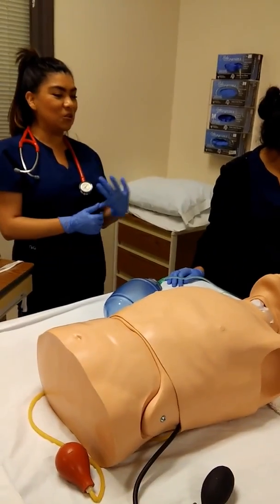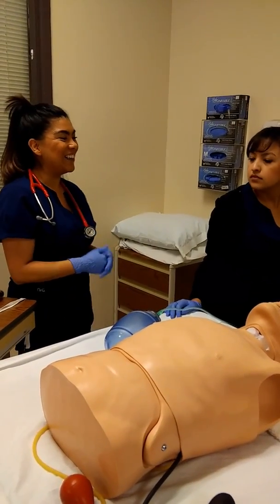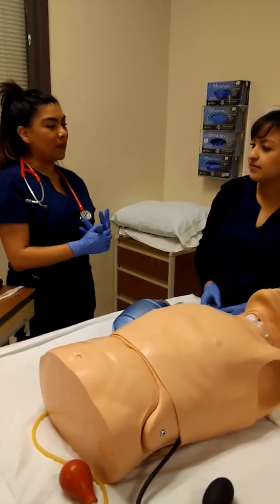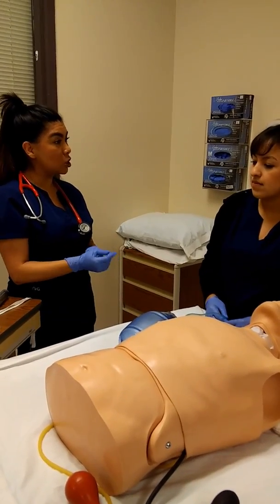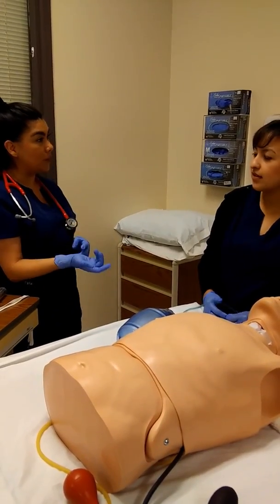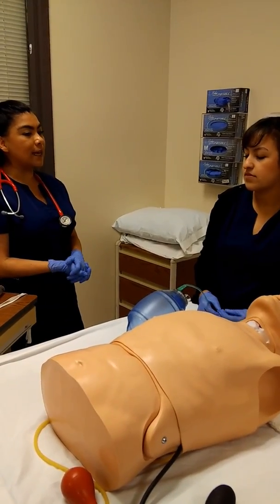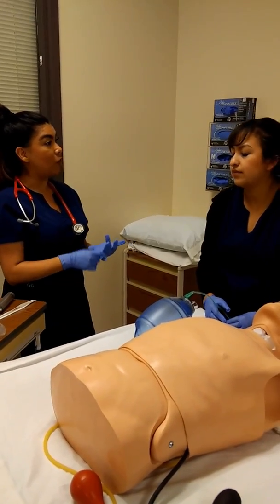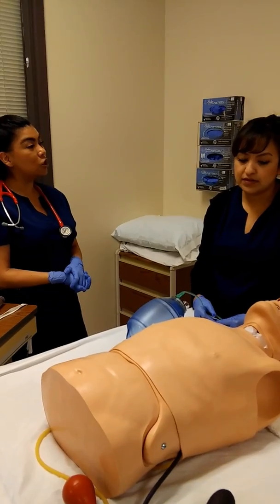Hi, my name is Mickey. I'm a respiratory care student, and it looks like your loved one is having difficulty breathing and maintaining an open airway. So we're going to intubate them to help open up their airway, to help them breathe better. Some complications that could happen is that the patient could have airway trauma, they could vomit and aspirate. Okay? Do you understand the procedure? Yes. Do you have any questions?